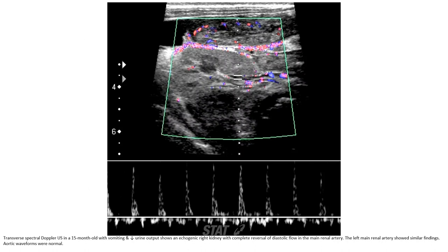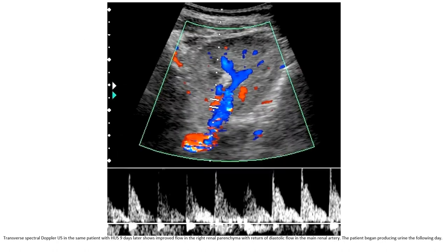This is a Doppler ultrasound of a 15-month-old with vomiting and decreased urine output, showing an echogenic right kidney with completely reversed diastolic flow in the main renal artery. The left main renal artery shows similar findings. A follow-up Doppler ultrasound in the same patient with hemolytic uremic syndrome nine days later shows improved flow in the right renal parenchyma with the return of diastolic flow in the main renal artery. The patient began producing urine the following day.